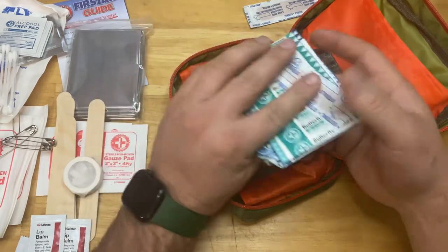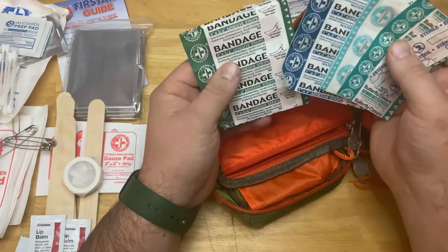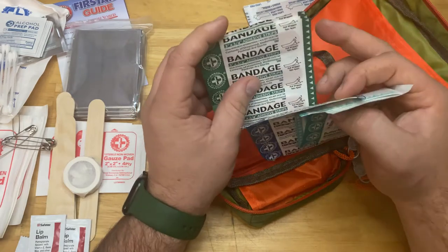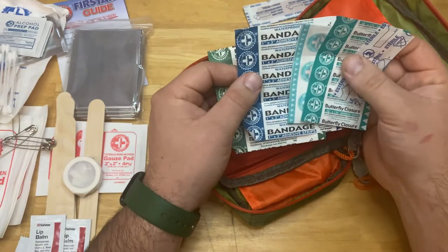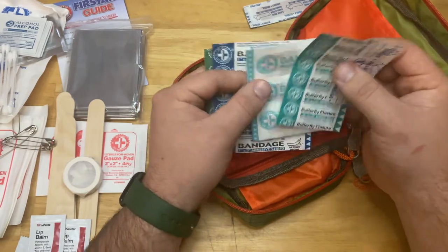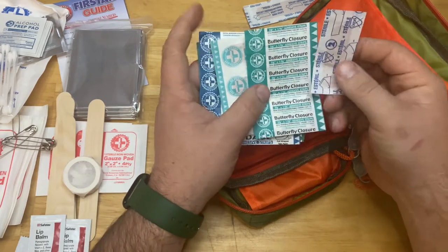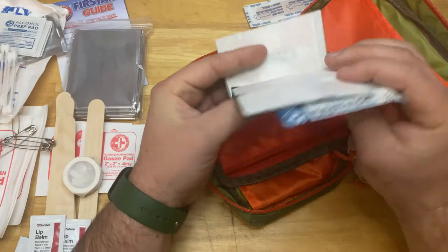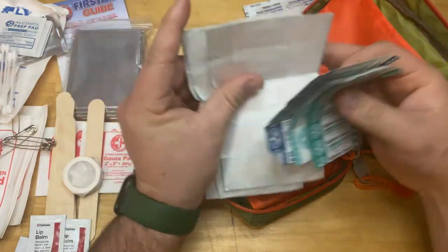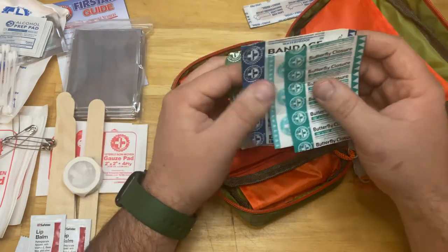There's a wide array of bandages: butterfly closures, regular band-aids in 1x3, 3/4x3, 1 inch by 3, and 5/8 by 2-1/4 inch sizes. There aren't a whole lot of each, but that's okay — I'd rather see some of the other specialized stuff than excess band-aids. You can walk over to the band-aid aisle and pick up an extra box for a dollar.